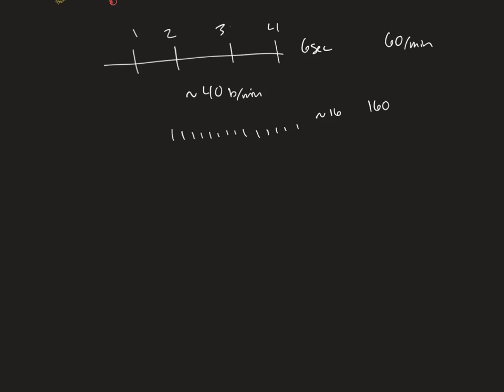Because the 12 lead is where you're actually going to see that duration greater than 120. You're going to see the RSR or the other morphologies of a right bundle. You're going to see the slurred S wave. This stuff is not visible in a rhythm strip. So don't say that you have a bundle branch block. You can say you have a widened QRS appearance on the morphology, but you're not going to be able to say, oh, they have a left bundle, unless they have a history of it and it looks wide, and then you can assume, but you can't definitively say unless you look at a 12 lead.